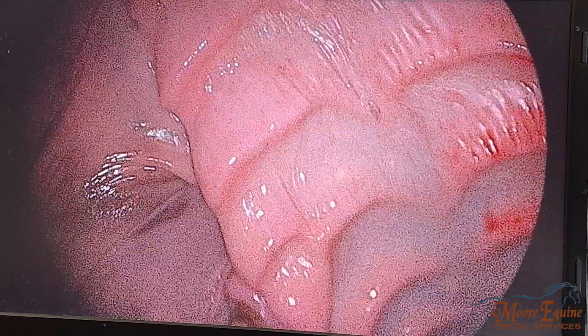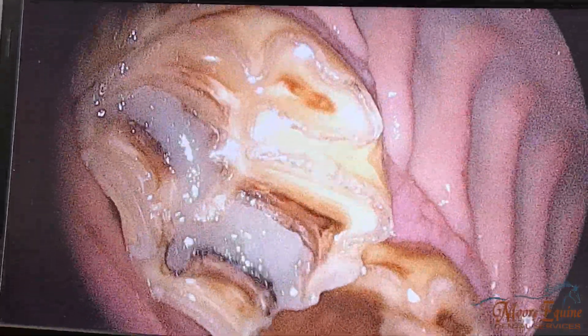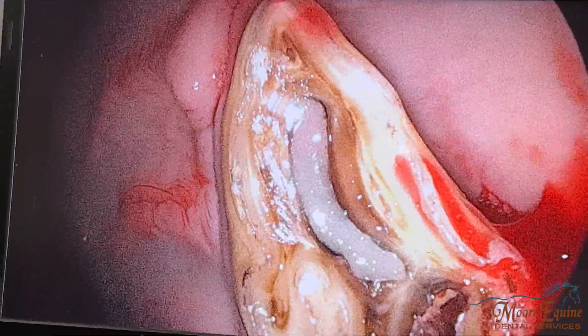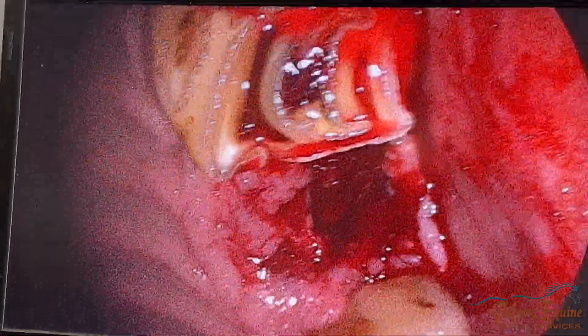This is a complex case, and with dentistry, the more you know and the more you look, the more things you find. It's not uncommon to have a horse with multiple issues, and we want to address them all as best we can. In this case we have to address the fractured facial crest and remove the bone sequestrum, take out the two root fragments, and perform infundibular restorations on the more severe and deeper caries to prevent fracture of those teeth. You can see it's a multi-modal approach. Here you can see the restorations done on 106, 107, and the mesial infundibulum on 206, and we extracted the two remaining fragments from the 208.